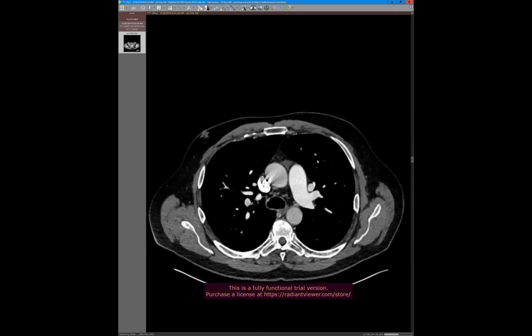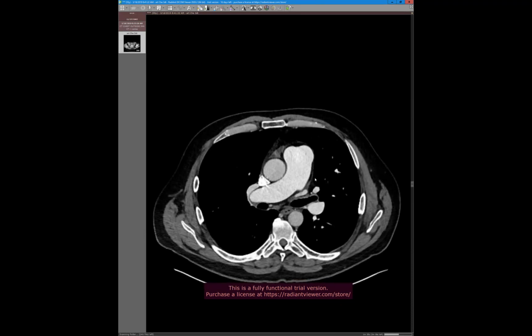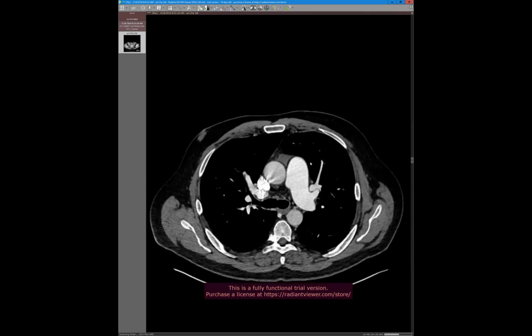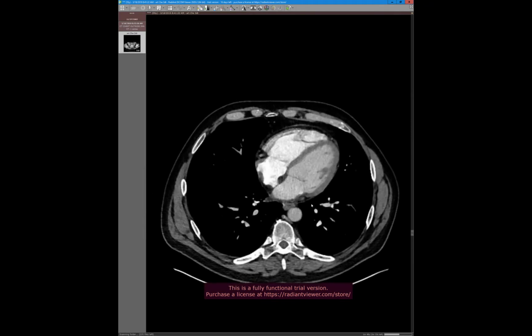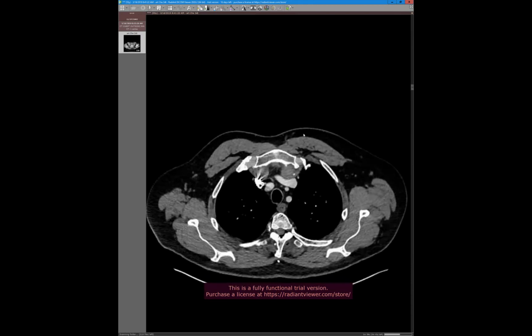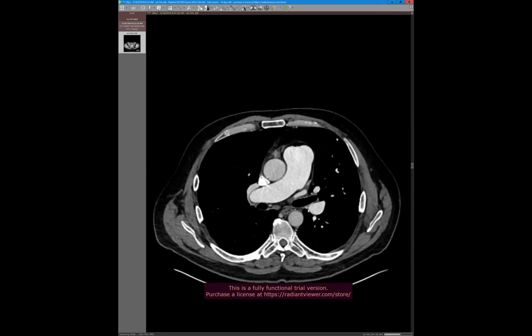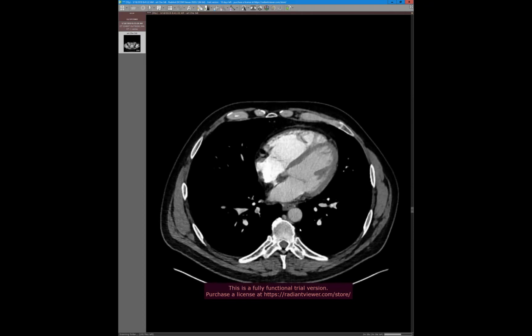I've never seen that. The surgeon had never seen that. And then we were kind of contemplating, because normally this would be a left to right shunt from the LA to the anomalous vein and then up and around into the systemic vein. But now, given that his pulmonary pressures are quite high, we were surmising whether we actually have retrograde flow and a left to right shunt turn into a right to left shunt, because the pressures in the systemic veins are actually higher than the left atrium, which they are.